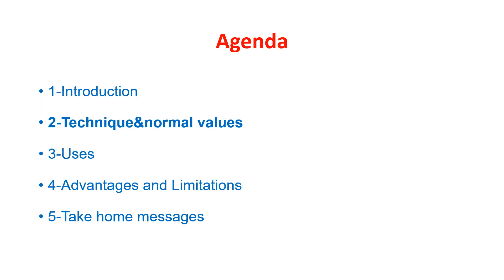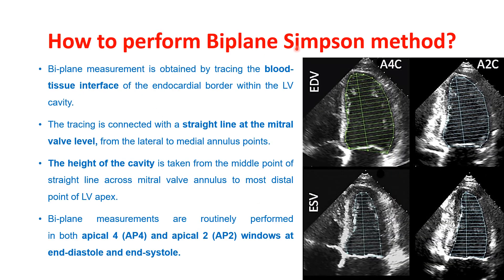How to perform the biplane Simpson method: the biplane measurement is obtained by tracing the blood-tissue interface of the endocardial border within the left ventricular cavity. The tracing is connected with a straight line at the mitral valve level from the lateral to medial mitral annulus point. The height of the cavity is taken from the middle point of the straight line across the mitral valve annulus to the most distal point of the left ventricular apex, as shown here.